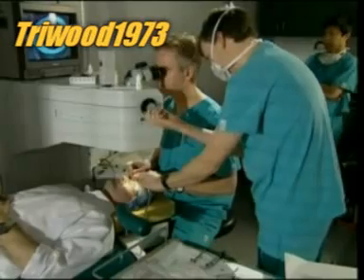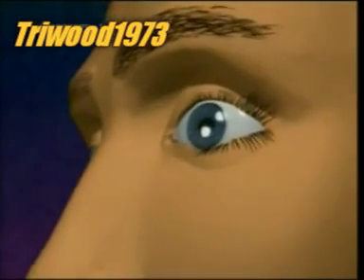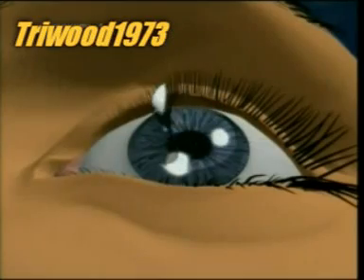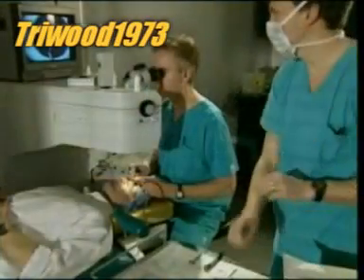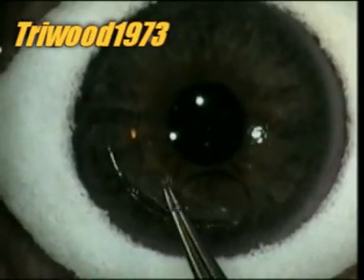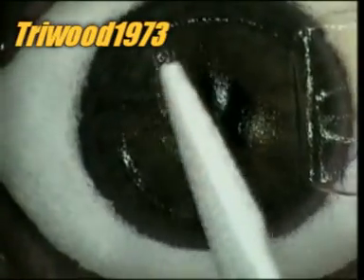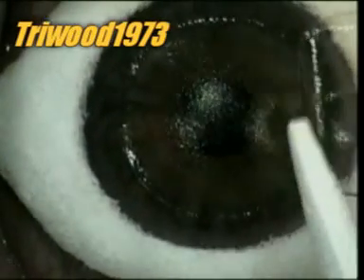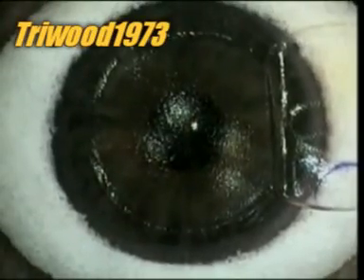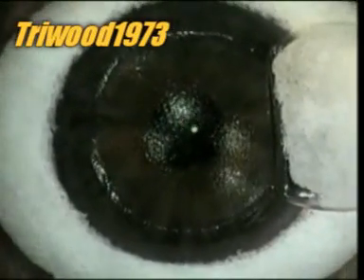The surgeon uses a sterile sponge to keep tears from contaminating the cornea. He folds back the flap of tissue, exposing the cornea. Then mops up the excess liquid and finally starts up the laser. Meanwhile, a tiny sponge keeps the flap moist.